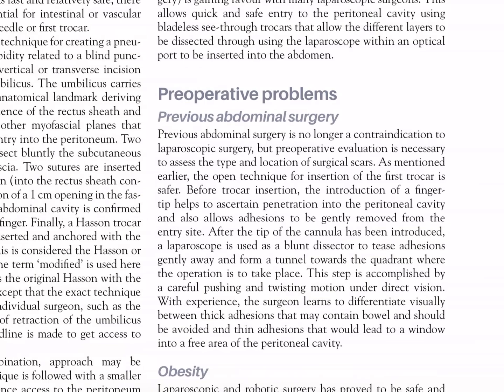As mentioned earlier, the open technique for insertion of the first trocar is safer. Before trocar insertion, the introduction of a finger tip helps to ascertain penetration into the peritoneal cavity and also allows adhesions to be gently removed from the entry site.